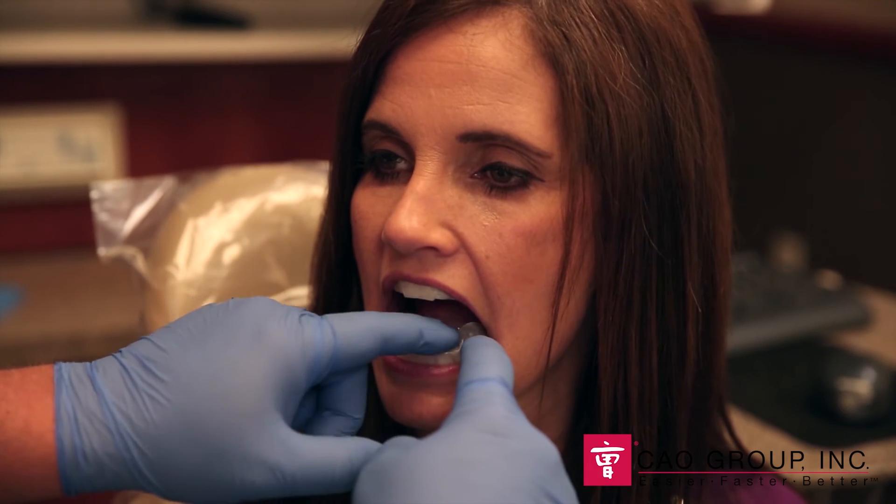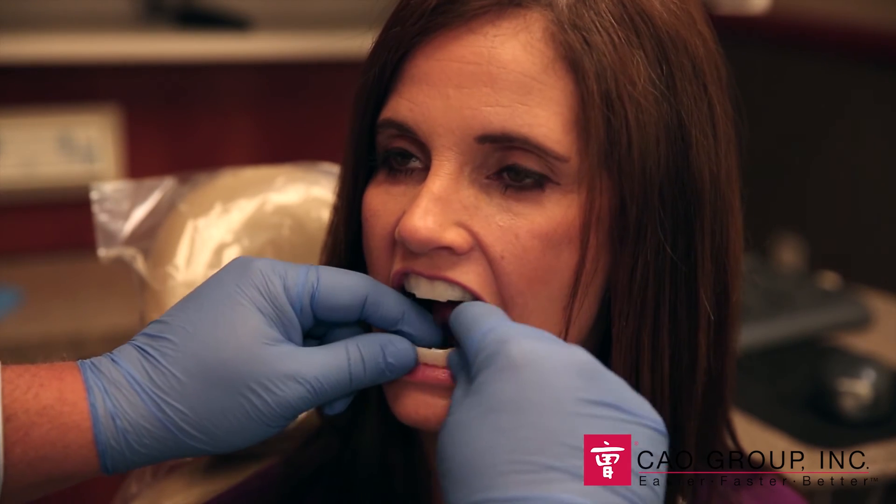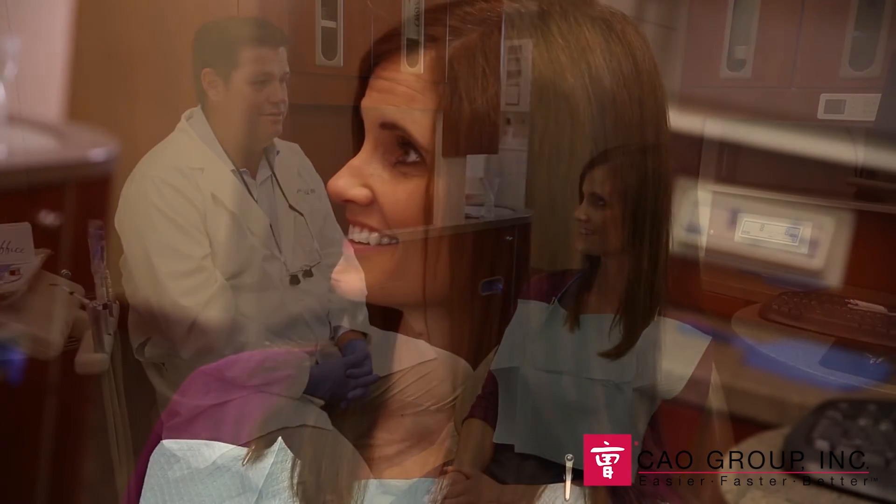And that's it. The patient is free to leave the office and go about their business as usual for the next 30 minutes. When the 30 minutes are up, the patient simply removes the Shear White In-Office Whitening Strips by gripping the edges and pulling down. What an easier, faster, and better way to provide in-office bleaching without even having the patient in the office.